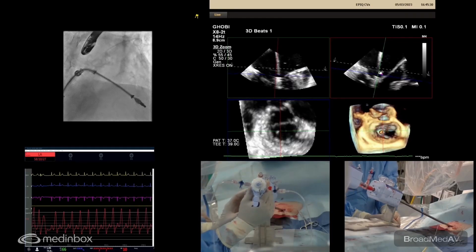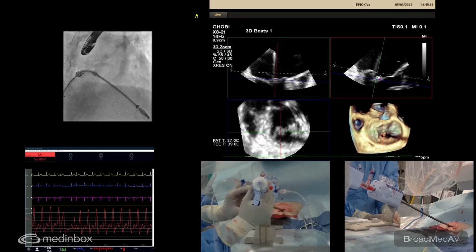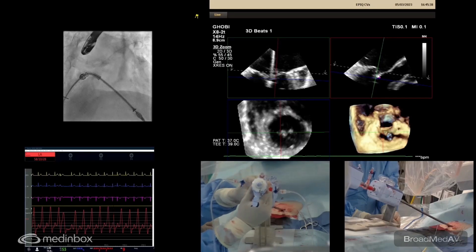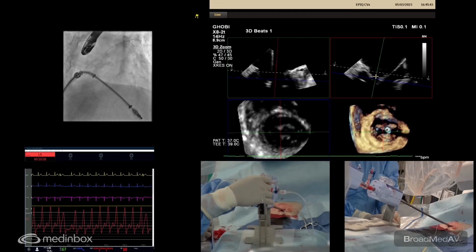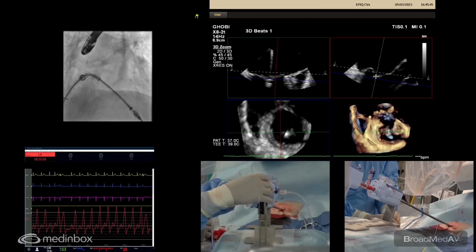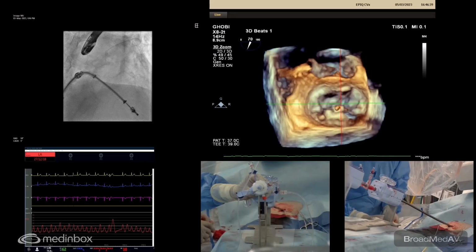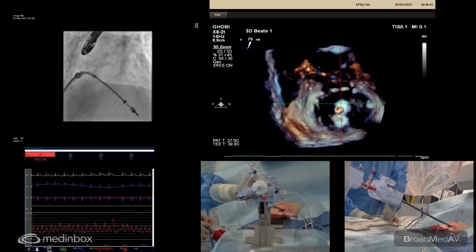Okay, so we went down, but it again dived a little bit lateral. There you go. Good correction. Good position now. Yep. Then I'll open the clip. Can you see the orientation better? Yeah, I will show you. I think this will be a good grasp here. Yeah, this is great.